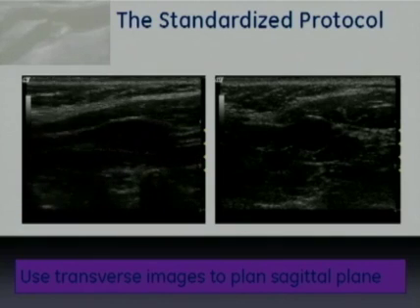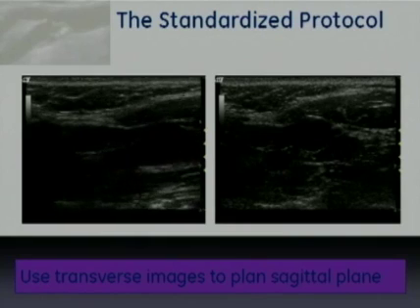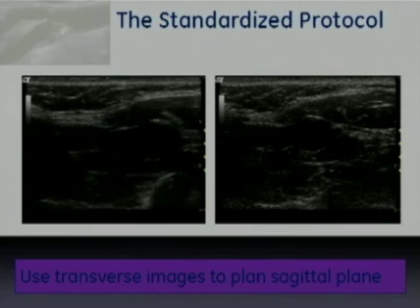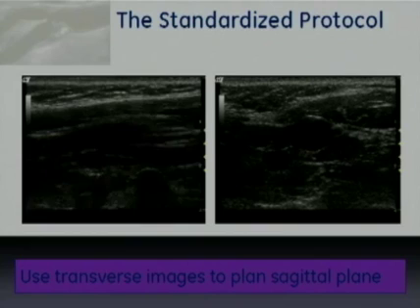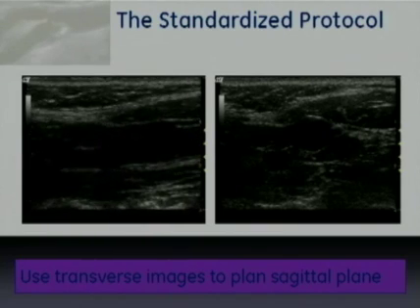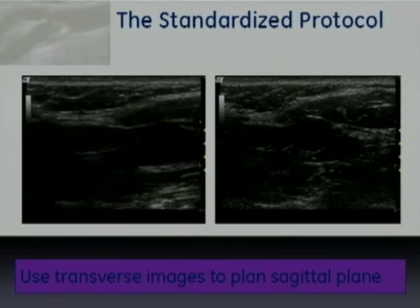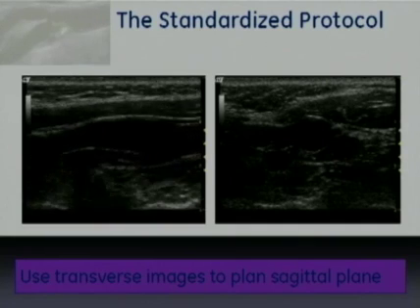This isn't a large motion, it's a very tiny motion because these vessels are actually quite close together, just going back and forth, and then making sure that each one of them ties back to the common carotid artery. Why is this important? Because it ensures that we're looking at two different vessels rather than one vessel from two different views. That's a mistake we might make if we pick up the probe and simply move it between the vessels. It's easy to look at the same vessel and mislabel it as two different vessels. So this will keep you from making that mistake.